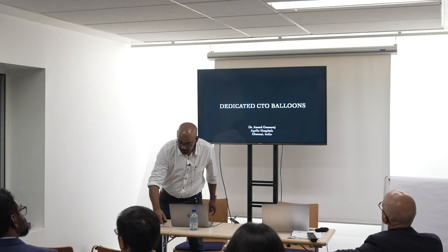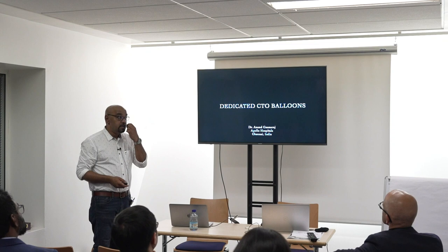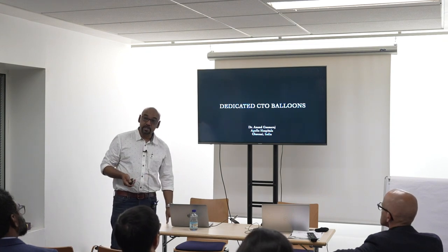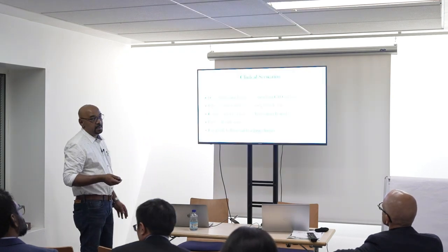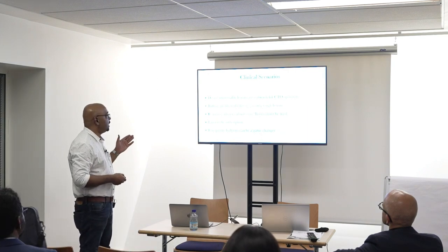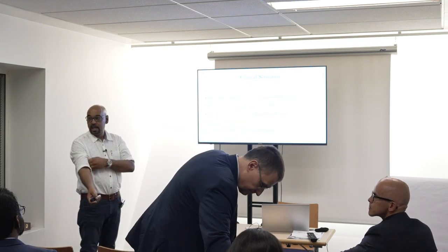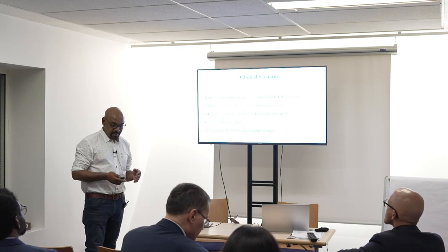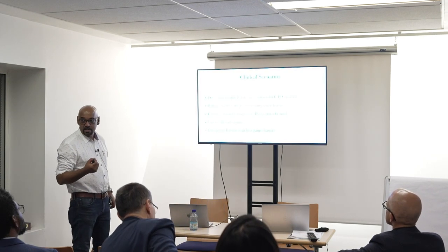Okay, so these are a few cases with a dedicated CTO balloon from BrosMed. I had the opportunity to use them in the last 1 month. The basic need of why a dedicated balloon is required is there are a significant number of device uncrossable lesions, which we end up with after crossing it. You take 2 hours to cross a CTO, and then nothing would cross. And balloon profile is the key to cross these lesions.